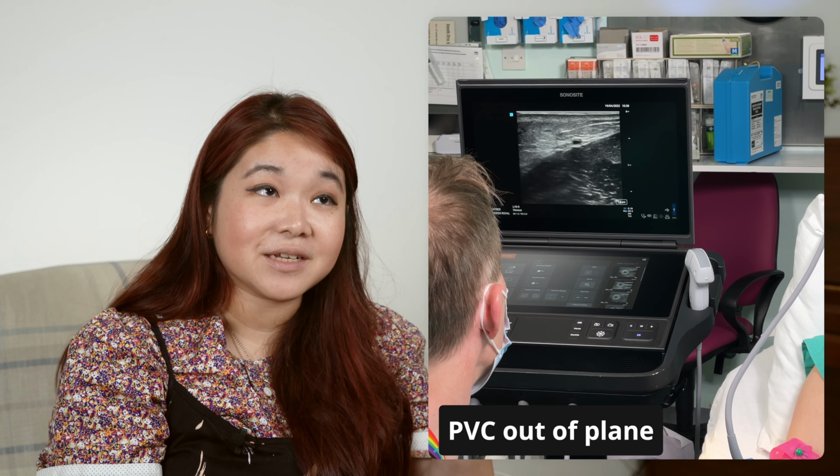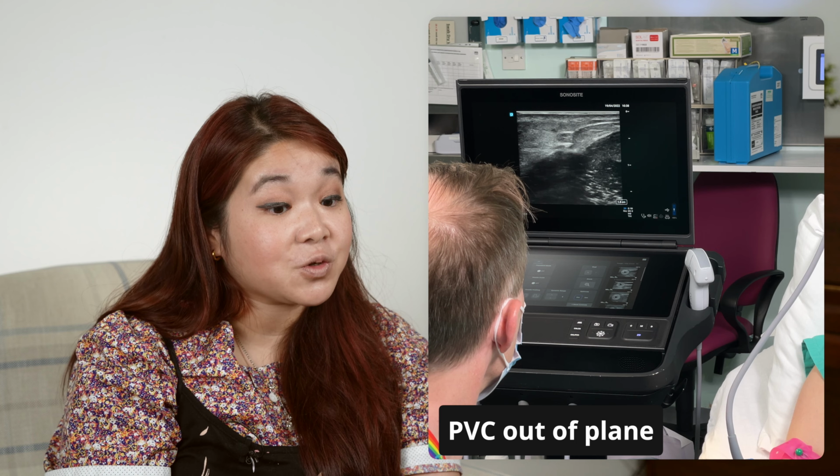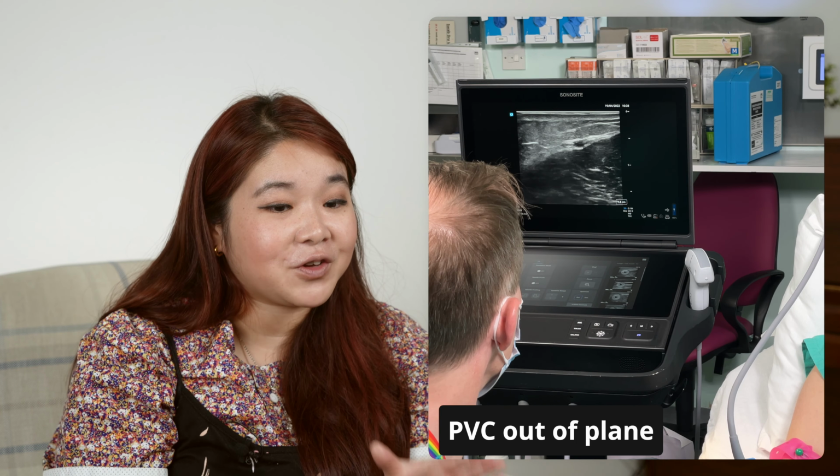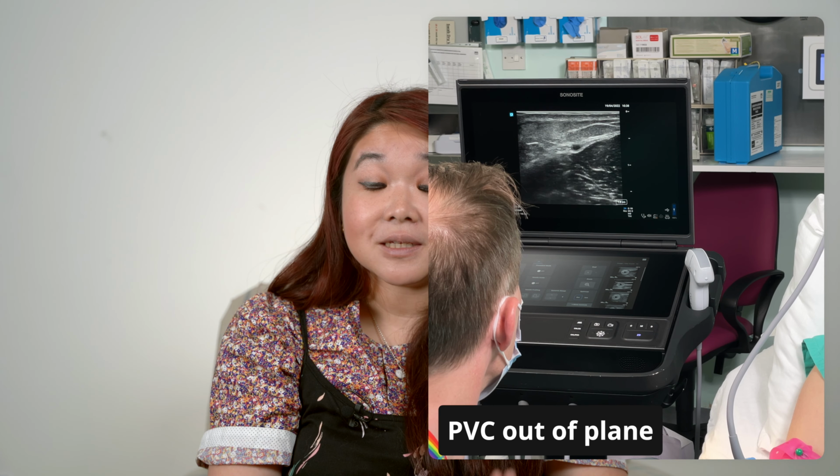So it takes repeated practice and good hand-eye coordination to find your needle tip. So don't be disheartened if during your first few attempts at scanning, you have no idea what you're looking at. You'll be able to get guidance from the tutors during the course to improve your scanning and needle visualization. So a couple tips that may help are to remember to make small adjustments with either the probe position or your needle, one at a time.